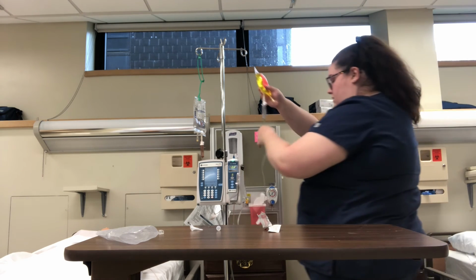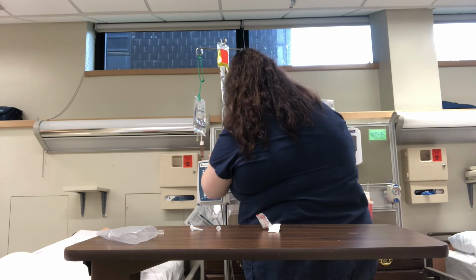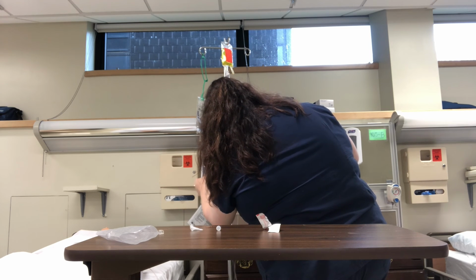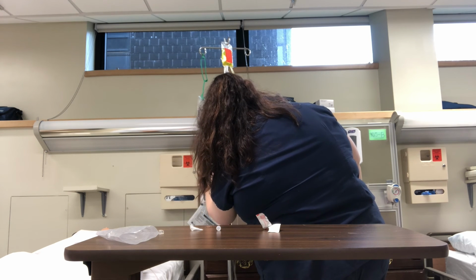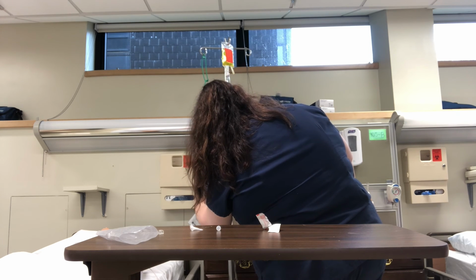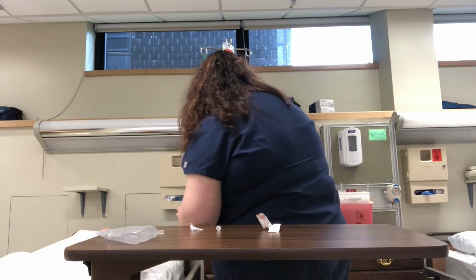Okay. Hang that. Now I'm going to add the secondary cefazolin. Running for an hour. All my clamps are open.